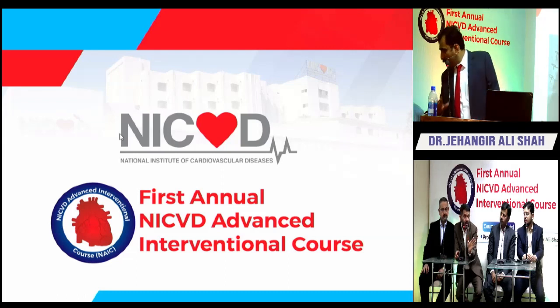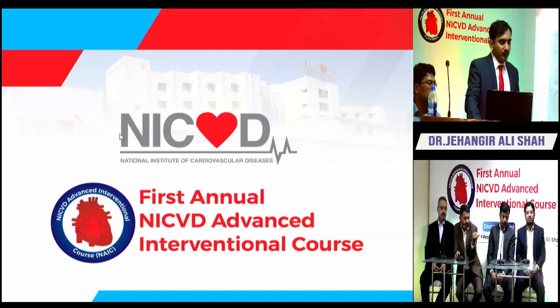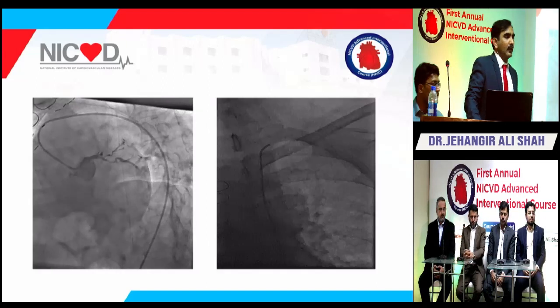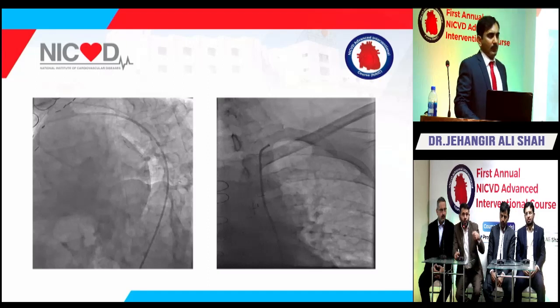the LV, left ventricle, is normal and this RCA is supplying the LV. So the LV will shut down. So for mechanical circulatory support, IABP will help. Yes, sir, do you agree with me? The main function of IABP is to augment the... Any question? IABP will unload the LV and give a little bit of support for the LV, so you can complete your procedure.